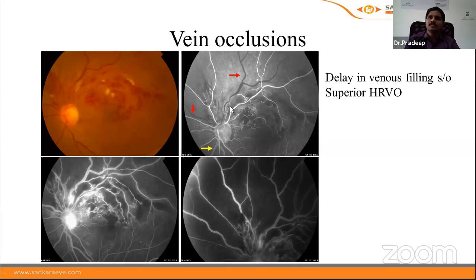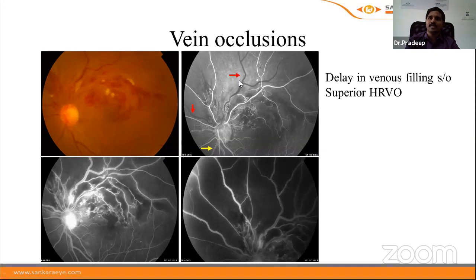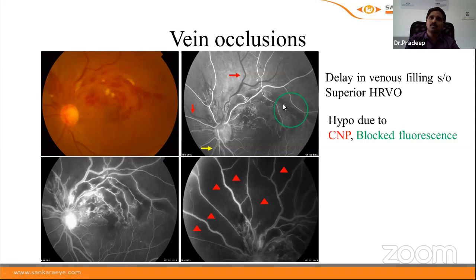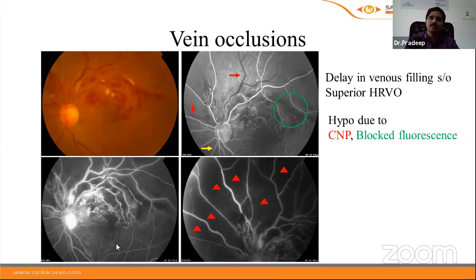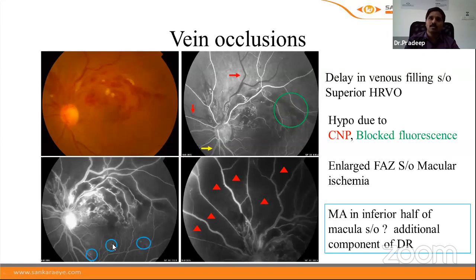In superior hemiretinal vein occlusion, there is a delay in venous filling in the superior half of the retina: the inferior half shows laminar flow while the superior half shows no filling in the retinal veins — both the superonasal and superotemporal veins. Hypofluorescence is present due to both block fluorescence from retinal hemorrhage and non-perfusion. Enlargement of the foveal vascular zone indicates macular ischemia. Tiny areas of hyperfluorescence suggest microaneurysms, pointing to an additional component of diabetic retinopathy.